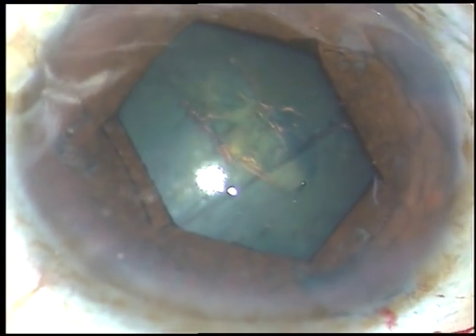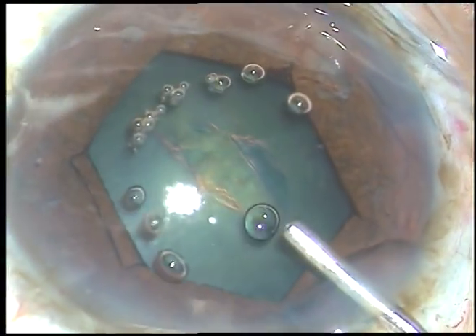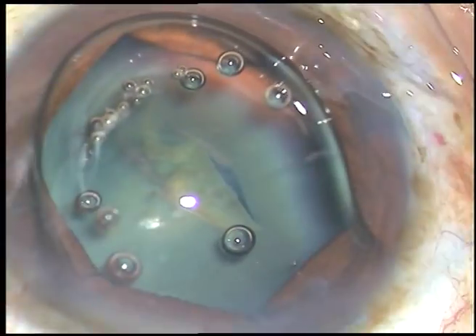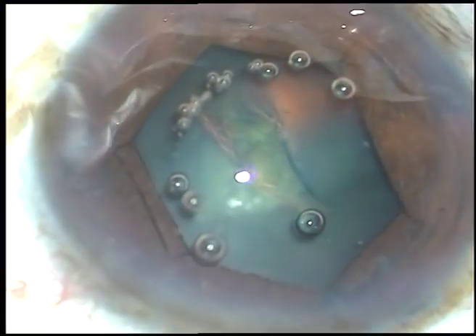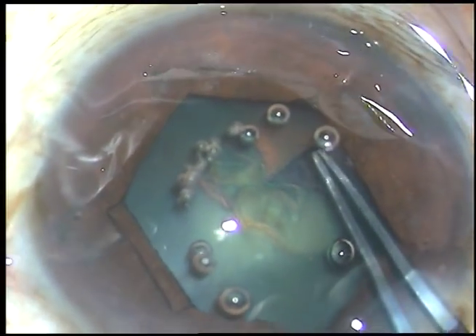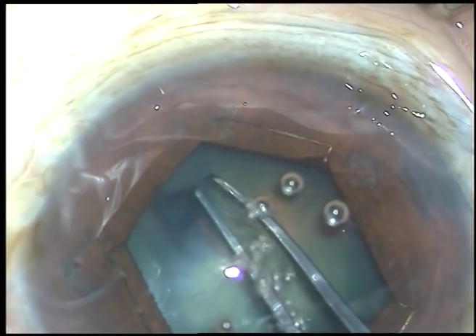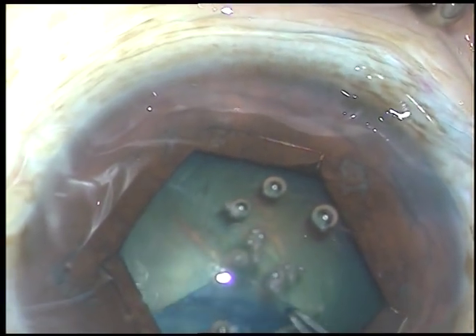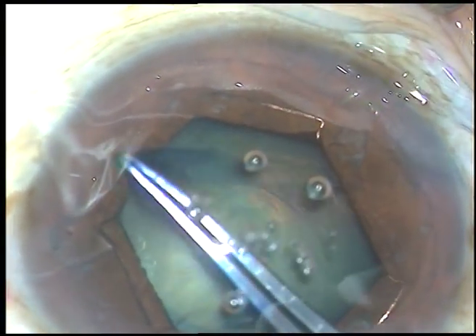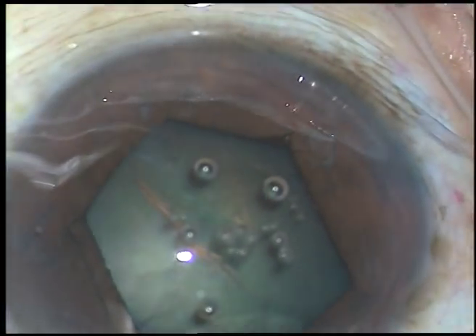By this time what has happened is the anterior capsule has been torn — injured by the forceps or by the flange. But it doesn't matter because anyway we are going to remove this portion of the anterior capsule. So I take a utrata forceps, hold this torn part of the capsule and convert this into a nice rhexis — a continuous curvilinear capsulorrhexis of about 5.5 mm diameter, as the pupil has expanded to about 5.5 to 6 mm.